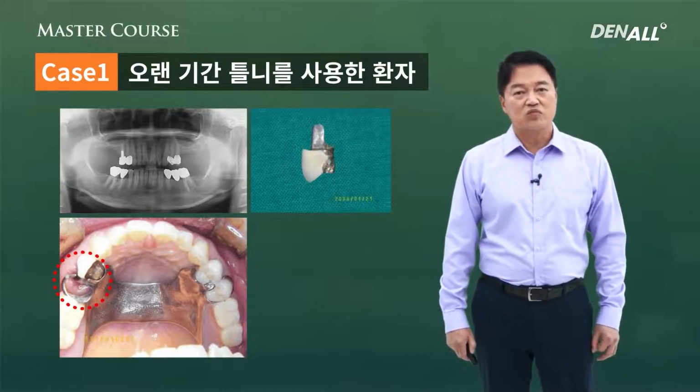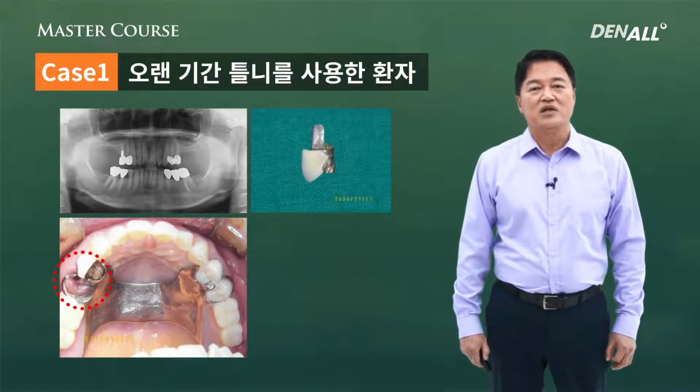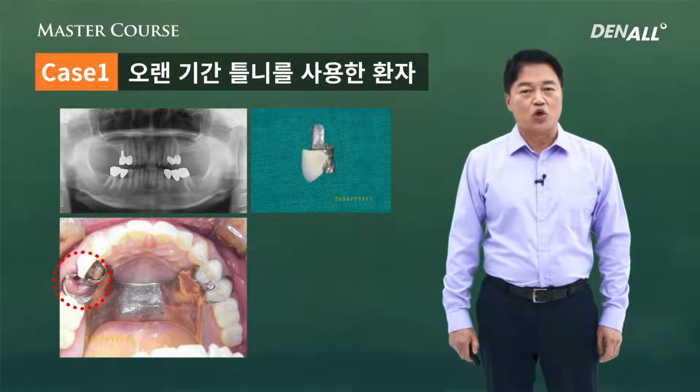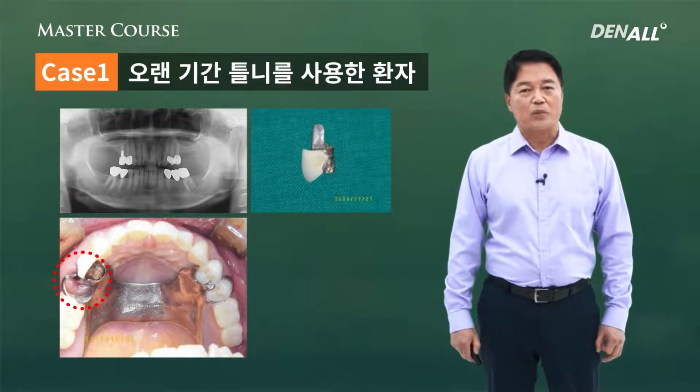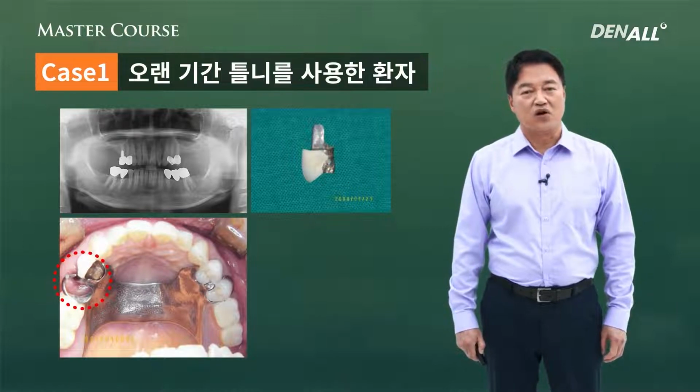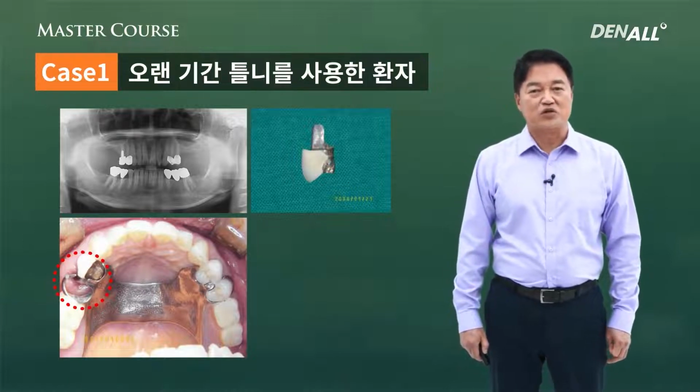If the patient had received implant treatment from the start, in the top left, the surveyed crown would have remained as a natural tooth, and the patient would have been able to use the bridged tooth for a long time.